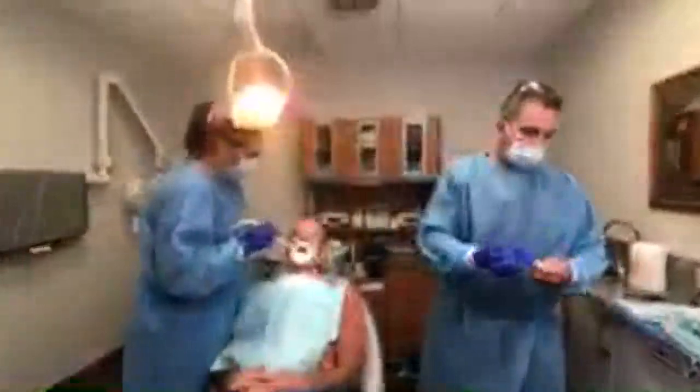We're going to be working on the bottom because he does have a few really bad teeth on top that we're going to be removing and placing something removable as opposed to something permanent. On the bottom, we're going to start off doing single tooth implants to give him a full complement of teeth, which is the best. On top it's going to be a less expensive removable option. We work toward what the patient needs, what they can afford, and what's best for the patient.